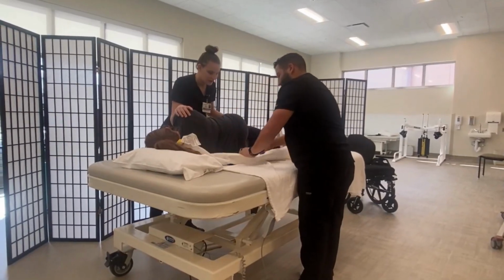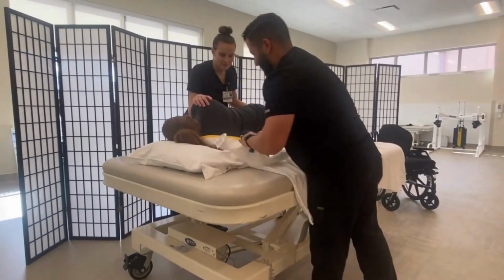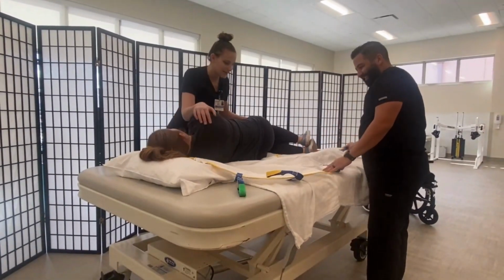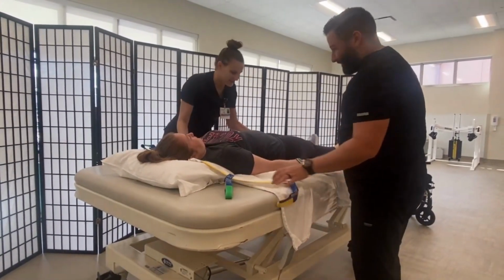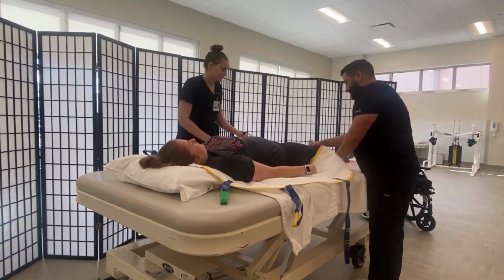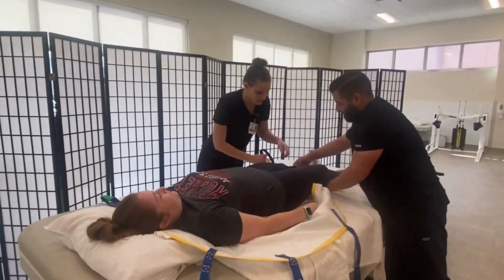In order to transfer a patient, a sling is placed under the patient while the patient is in bed or in a chair. When in bed, the patient can roll from side to side with assistance from the healthcare provider as the sling is placed underneath them.